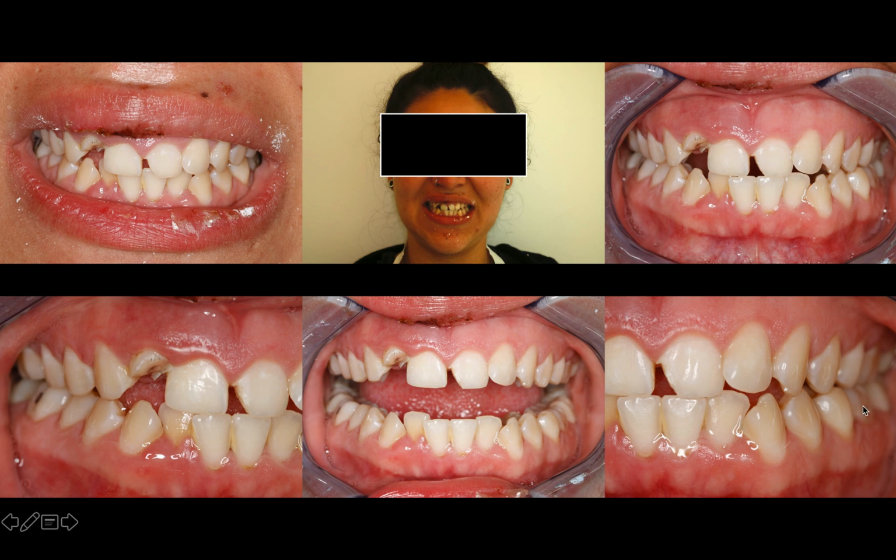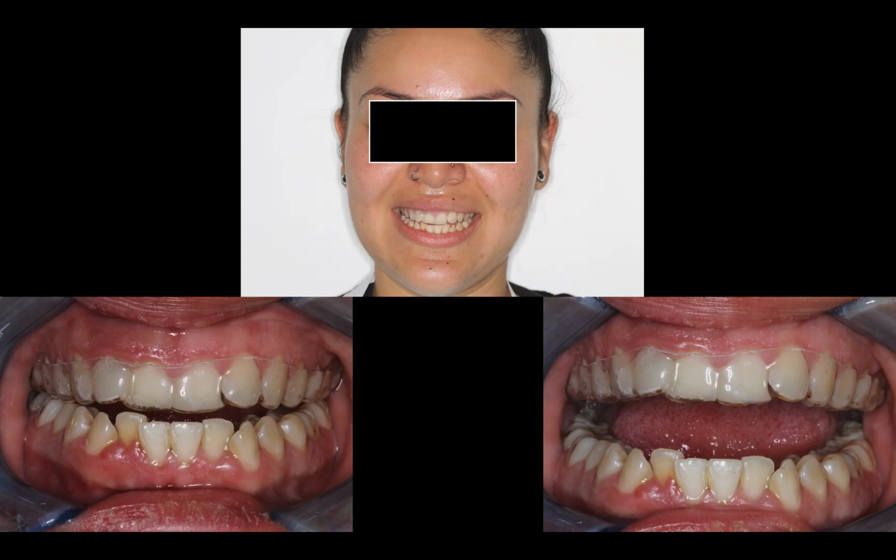and a little bit of active decay, which you'll see better pictures of back here. But overall, this is where we were. So again, we took impressions and radiographs, and then 2 days later, again, she first saw me on Tuesday. We saw her on that Thursday. I delivered this Essex retainer that she could wear. That way, when she was going out and about, she didn't look like she was having a missing tooth.